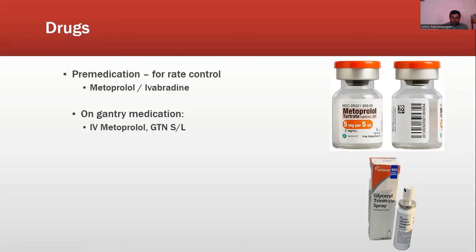do is, after the patient arrives to the department, we measure the heart rate and the blood pressure, and we try to cool down the patient, we try to relax the patient, which is very important. So we should have trained nurses and the presence of a cardiac imaging consultant, cardiac radiologist, in the scan room, so that he can reassure the patient, because this is not going to be like a normal CT, so we reassure the patient.